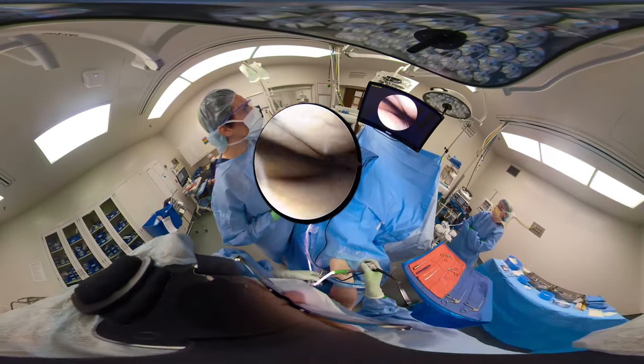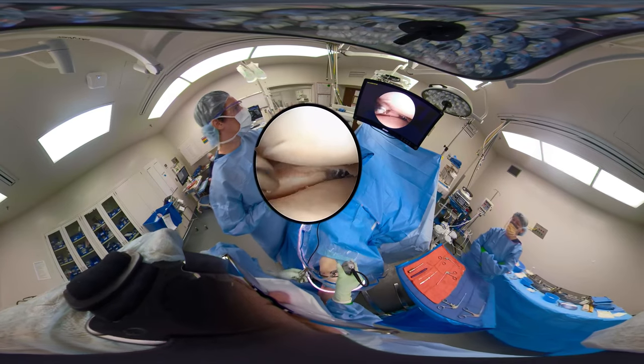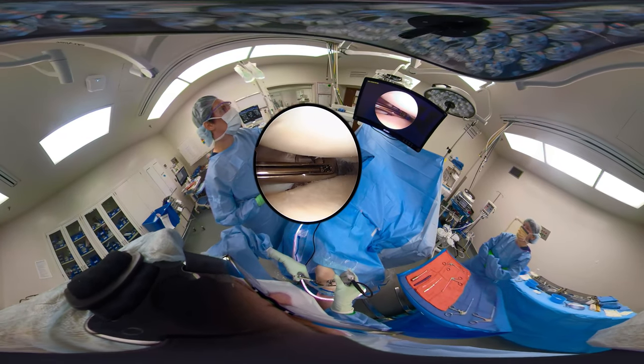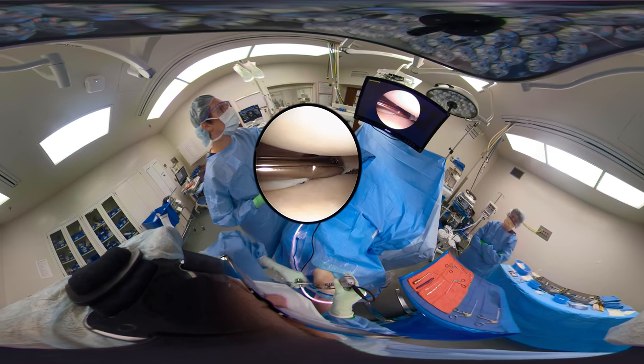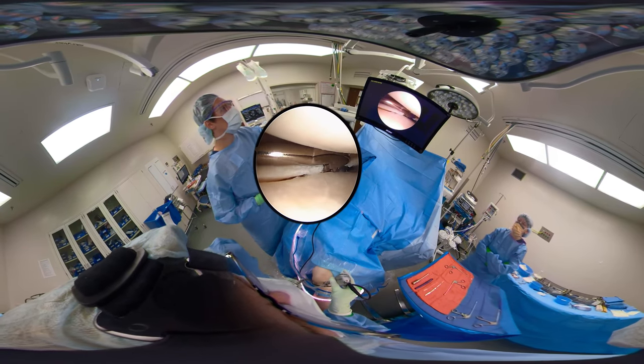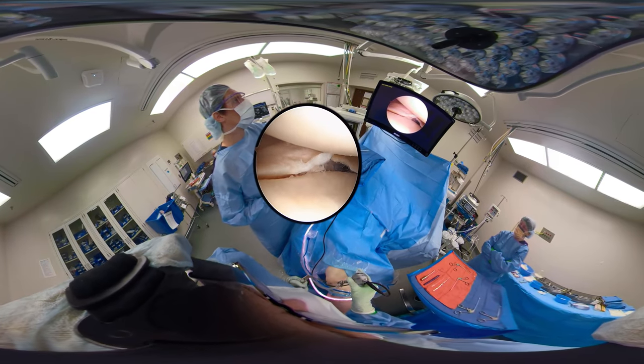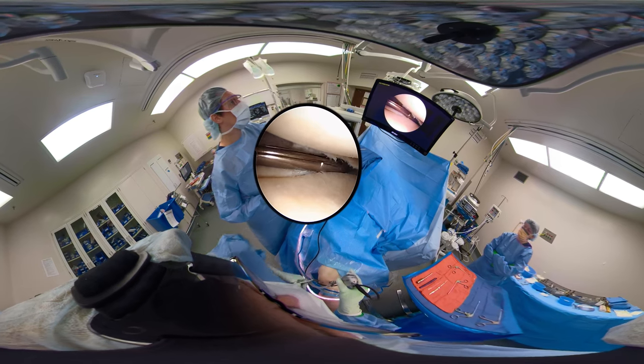There's a back-biting handheld duckbill — a left-to-right and one to the left. I'm trying to open the joint up enough to, in a reverse way, remove part of that medial meniscus. We can also do this by switching our scope, but you can see here where the reverse biter works pretty well as well.